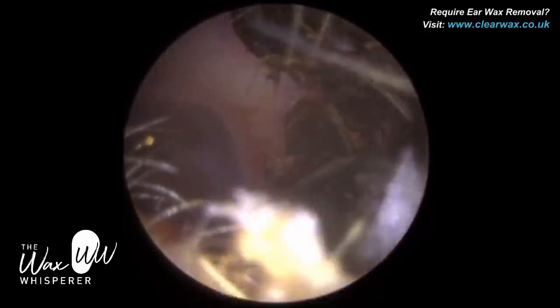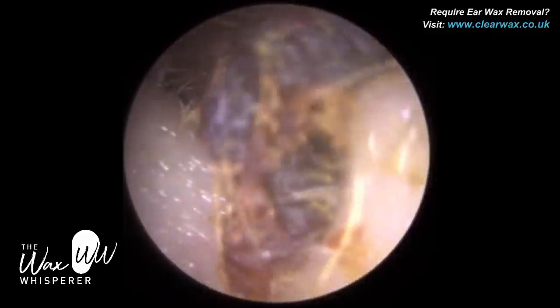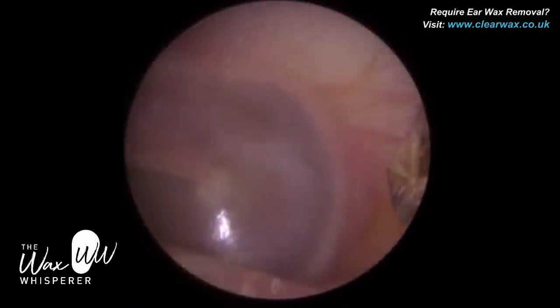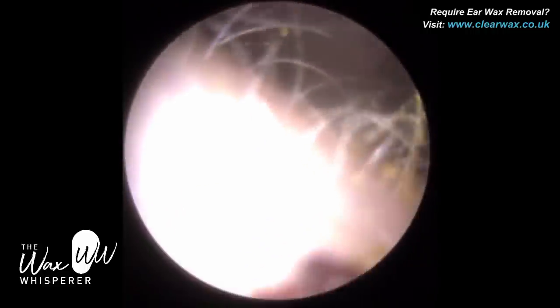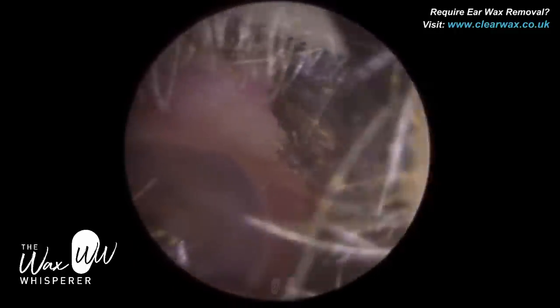So for me, I wanted to avoid microsuction at whatever cost here. Fortunately, there was a big opening at the top, the roof of the ear canal, so I just used a jobson horn to delicately get in and behind the wax. Now this wax is a good consistency for using a jobson horn.